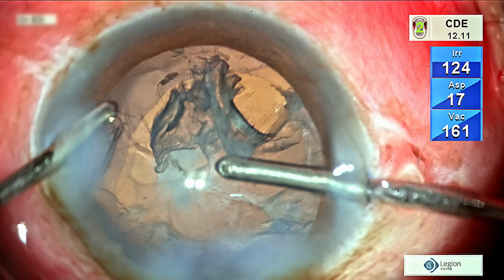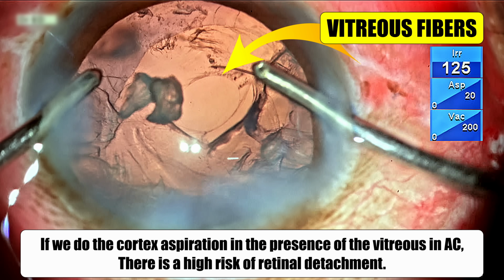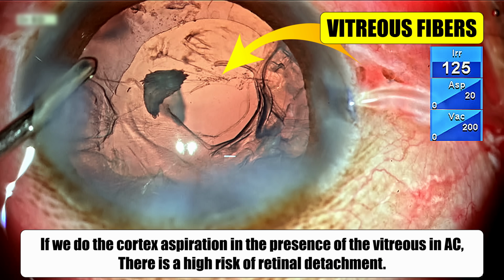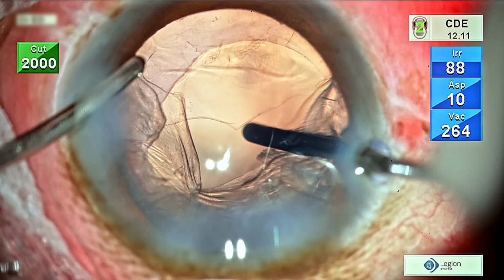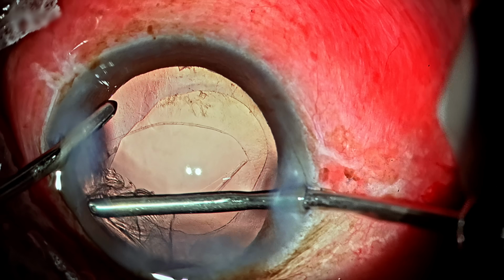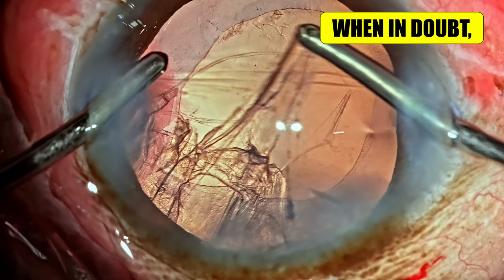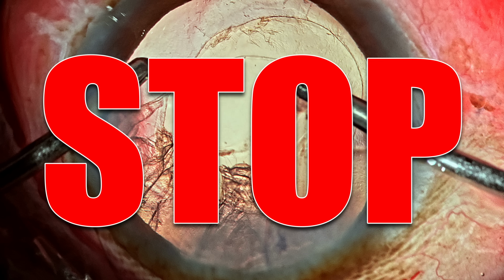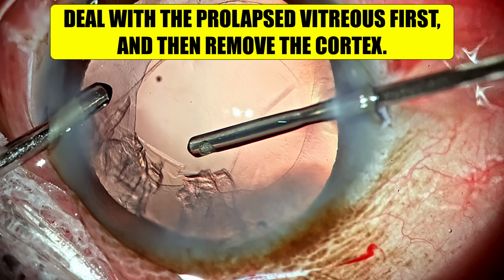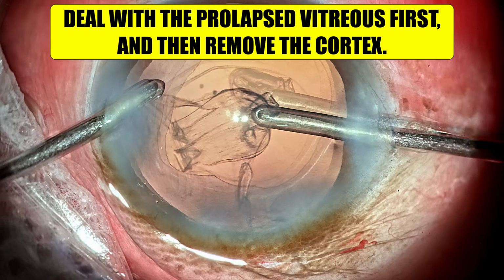Because if you attempt to remove cortex and there is prolapsed vitreous, we're going to cause traction at the vitreous base, and that can induce a retinal tear that is much more difficult to treat. So always first perform vitrectomy and then do a cortex aspiration. Whenever during cortex aspiration we have a doubt that the vitreous has prolapsed again, it is required for us to stop the aspiration of the cortex, deal with the prolapsed vitreous, and then proceed with irrigation aspiration.